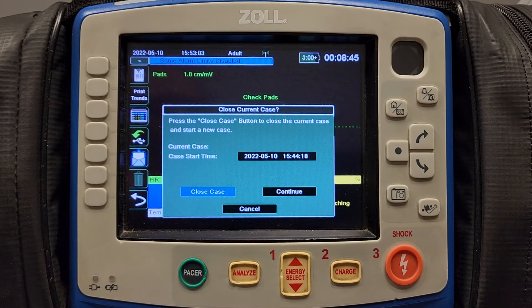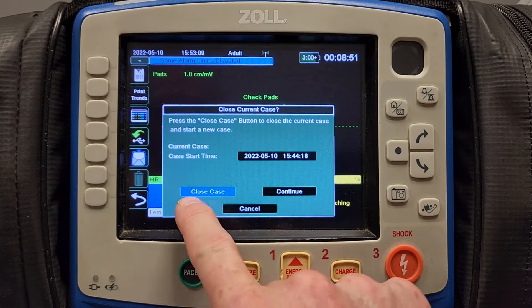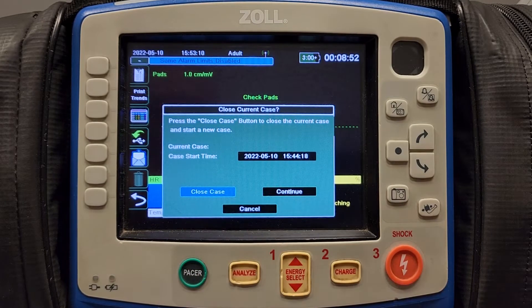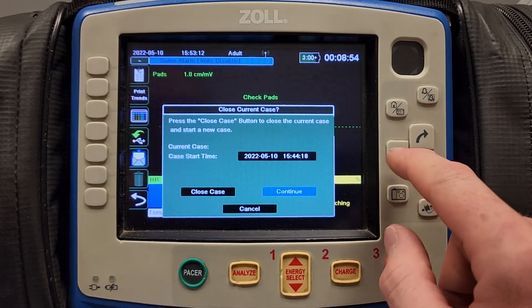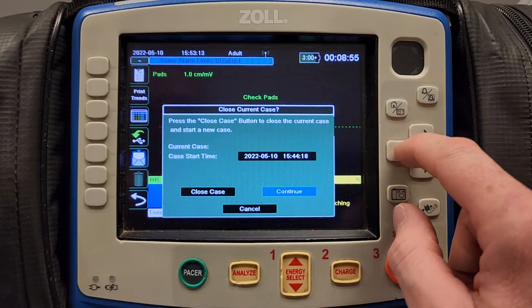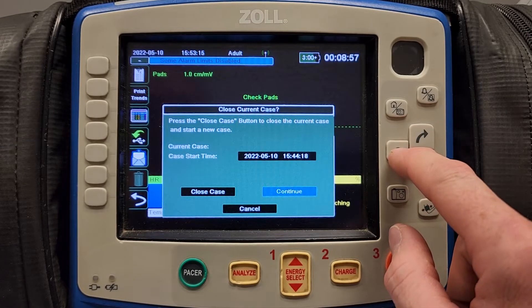If you are uploading a set of vital signs that was taken earlier that day or a previous day, you can hit close case or continue. I'm going to hit continue because I'm uploading vital signs that were taken earlier today.